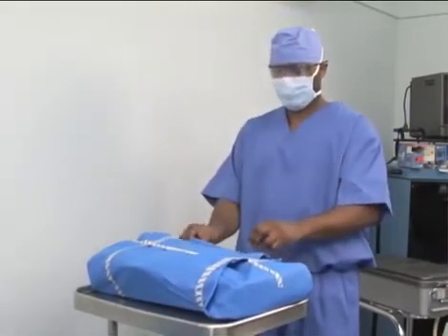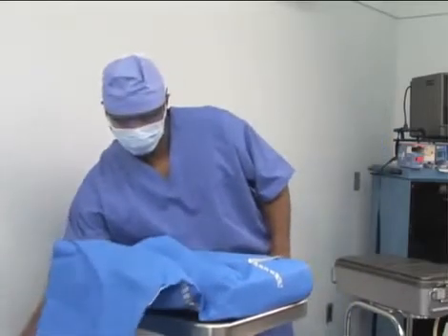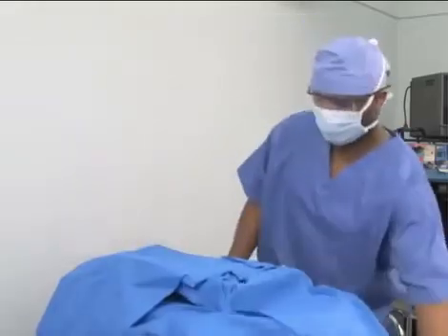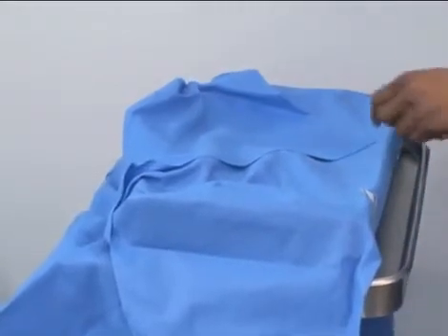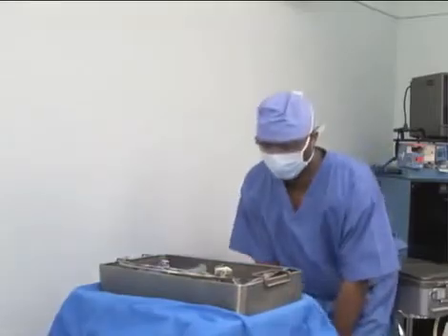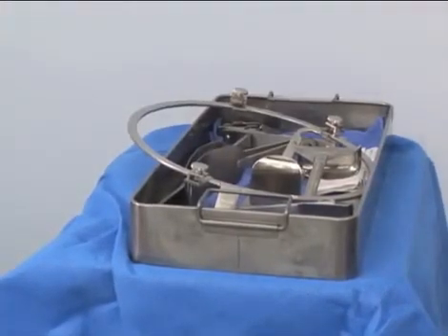Orient the item so that the flap farthest away from the body is grasped first. The flap is opened away from the body and gently pulled down. Open each side flap. Open the flap closest to the body last, pulling it towards you. This prevents the non-sterile arm from reaching across the sterile surface inside the pack.